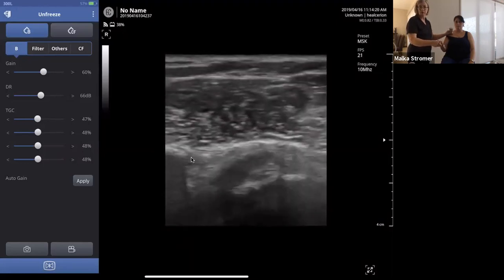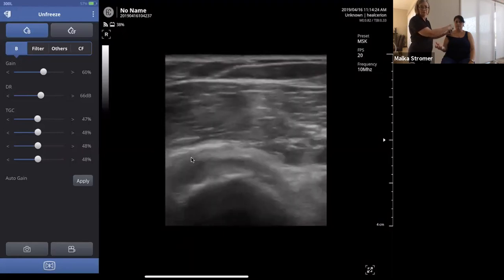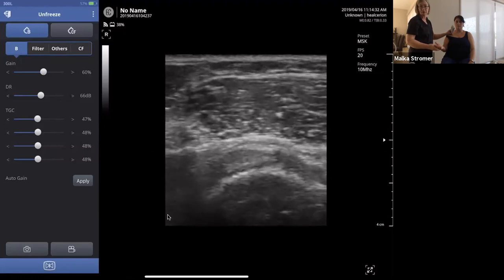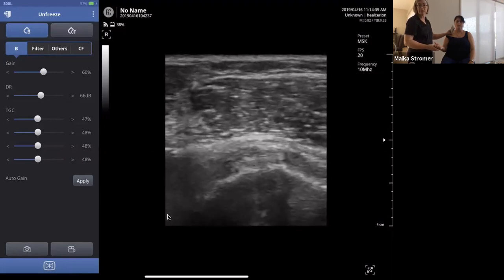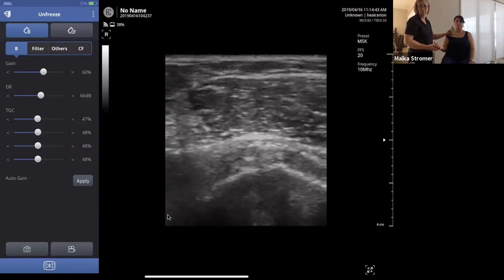Okay, go back to this long axis. I'm going to rotate this 90 degrees. Now we have a short axis view of the subscapularis, and it's a multi-pennant tendon. So you'll see the little bundles within that. That's perfectly normal. I had a tendency at first to think that that was an abnormality in there, but that is the composition of that tendon, so that is normal.